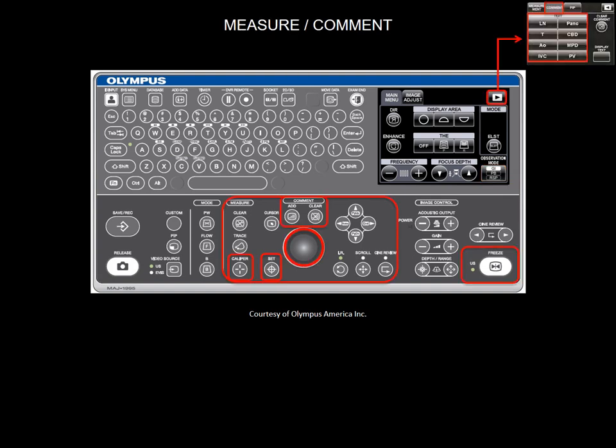You can take measurements and type comments. Press the caliper button to show the caliper marking, then move the caliper to the starting point with the trackball. Press the set button to anchor the caliper, and move the trackball to the end point.